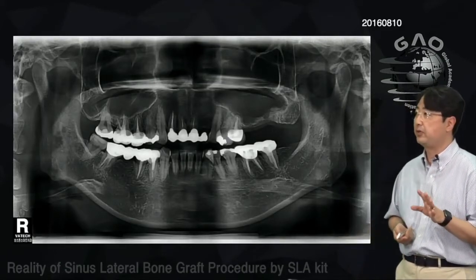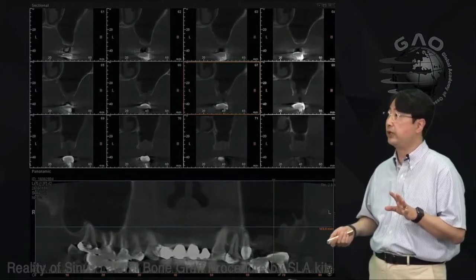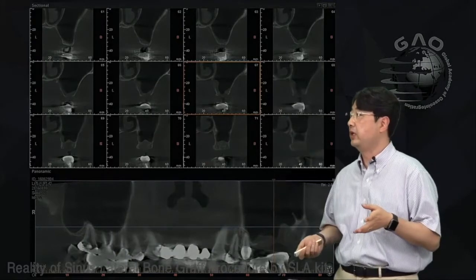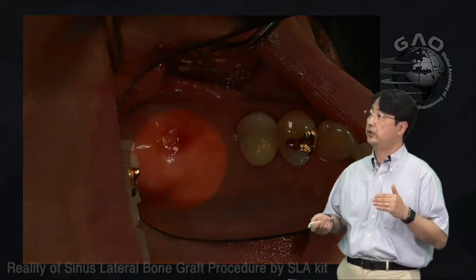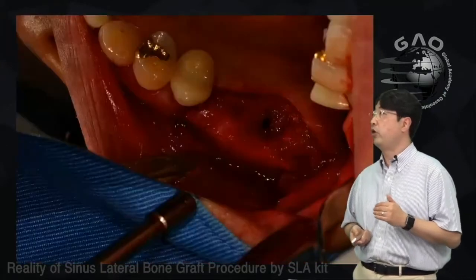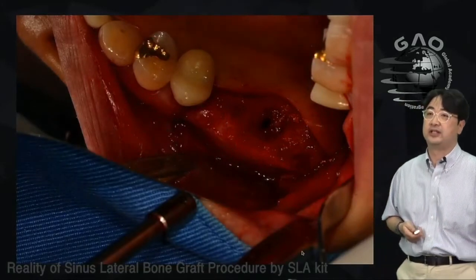She came back and the membrane thickening was gone. But there was still a problem — an opening in the crestal area, visible on CT. The membrane thickening appeared to be of odontogenic origin. In the clinical picture, you can see redness in the crestal area around number 27. When I opened the flap — with an intentionally extended palatal incision — I found the opening and a perforation of the membrane.